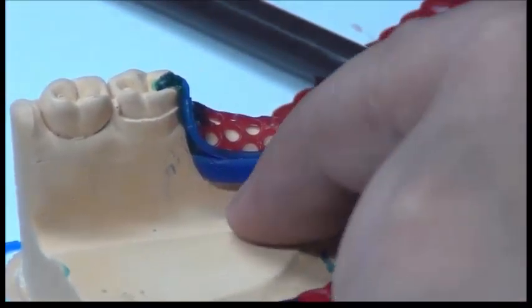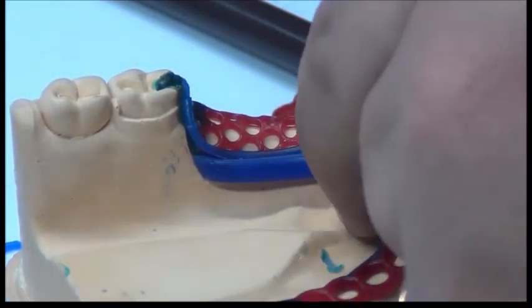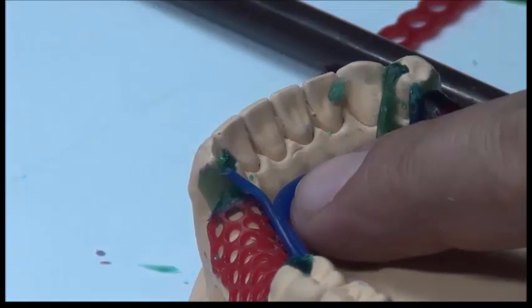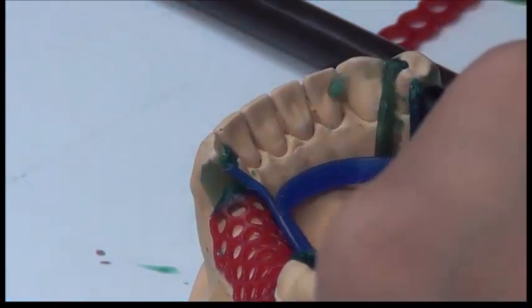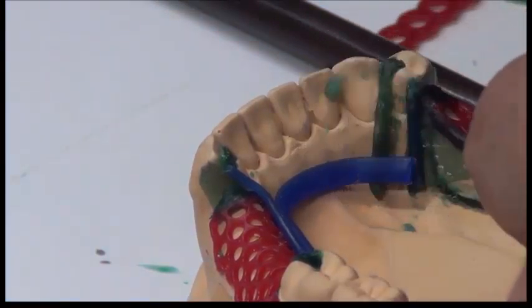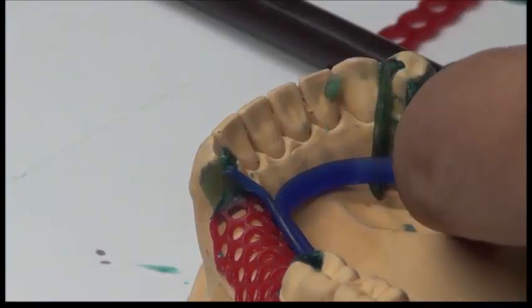It runs beneath the external finish line. It's not in the full sulcus depth, it's away from the full sulcus depth. On the anterior part, it's 4 millimeters away from the marginal gingiva of the teeth. And it runs to the other side up to the external finish line. It stops here. Here in the free saddle, the whole sulcus area will be filled in with acrylic. That's why it ends here.